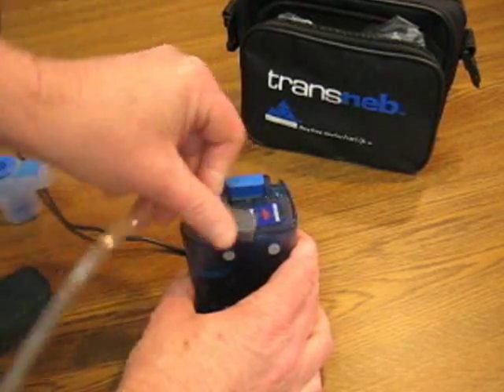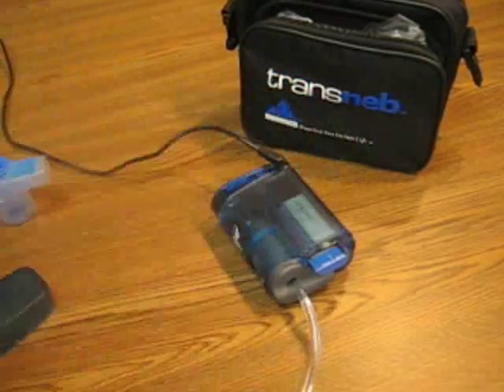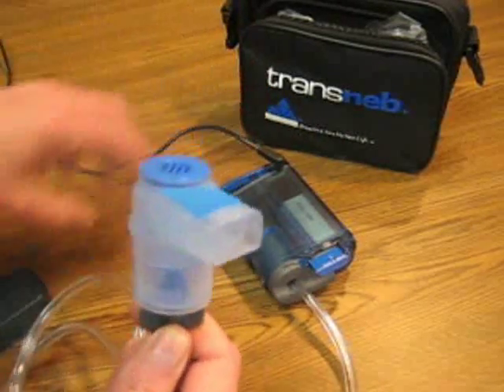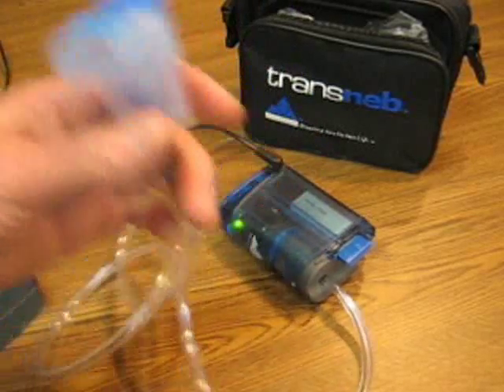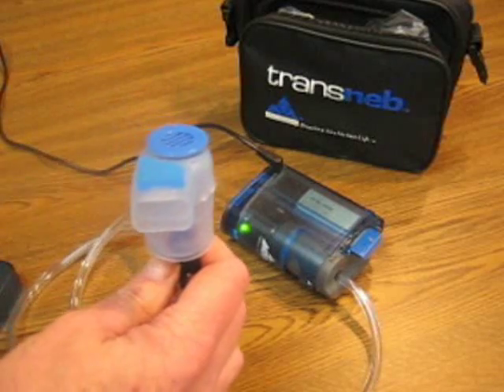Put it in and turn that flange to lock it into place. The compressor has four feet that you can now lay it down with. On the other end you have your medication cup, and now you simply turn it on and you can take the treatments without having to hold the compressor.